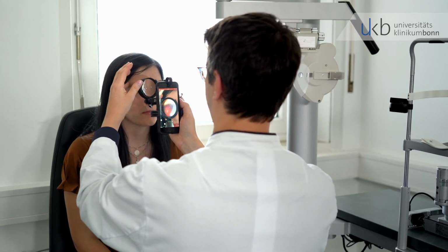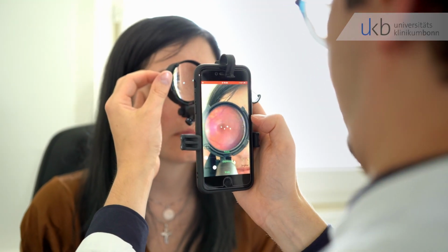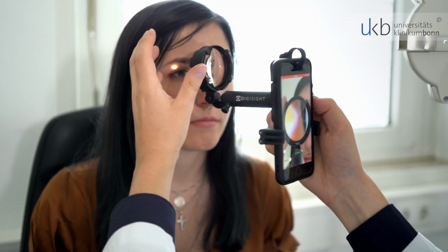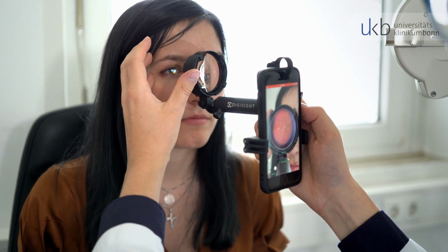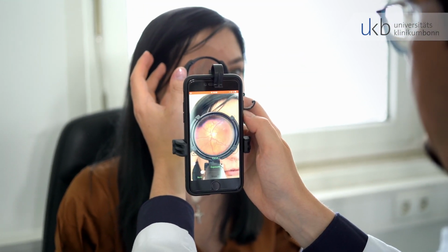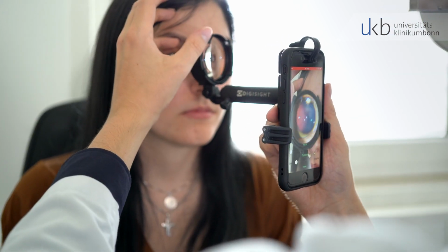While it is relatively easy to image the macula and the disc, the periphery can be a little bit challenging. There are two options for imaging the periphery. The first option is to instruct the patient to look in different directions so that the area that you want to image gets into your field of view. The second option is to change the angle of the adapter and thereby your field of view. The second option is faster, but requires a little bit more experience.